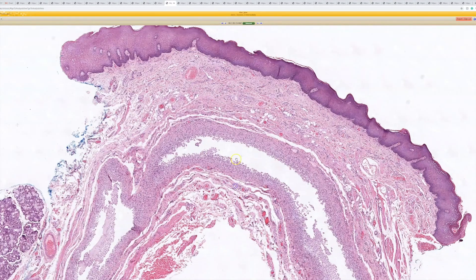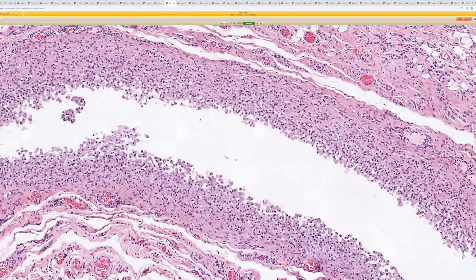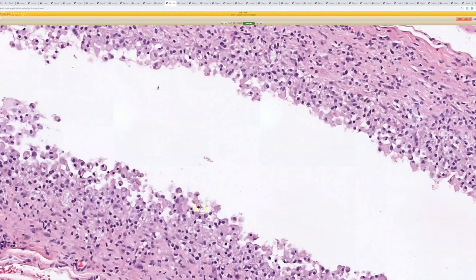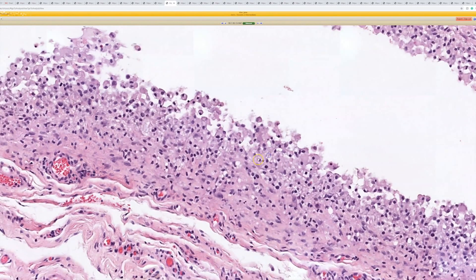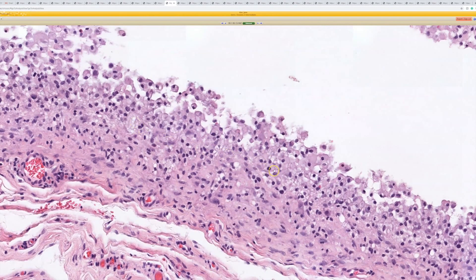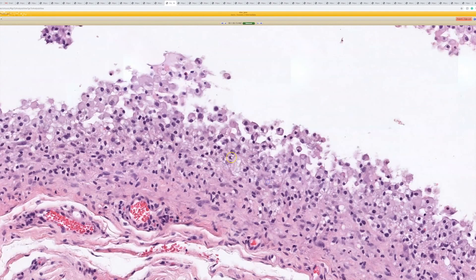Here what you have is a cystic space — it's actually a pseudocyst, lined not by epithelium but by a thick layer of histiocytes filled with a kind of gooey mucin material. They look almost foamy, but instead of having tiny vacuoles they have this fluffy, loose stuff inside. Basically, a salivary duct ruptures, the mucus and salivary secretions spill out, and then histiocytes come in and mop it up.